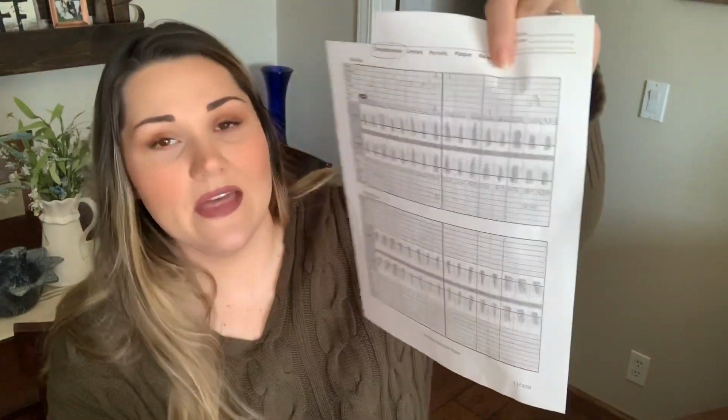But if it's easier for you to do a certain way, don't be afraid to tell your hygienist, hey, can we do it this way? It's easier for me to enter it. Usually they're just thankful to have someone in there to help with perio charting. So just communicate with your hygienist, see how they enter it, and ask if they could do it a different way if it's difficult for you. Every hygienist is different and they will enter it a little bit differently, but this is the most common way. And then they will go down to the lower teeth and do the same thing.